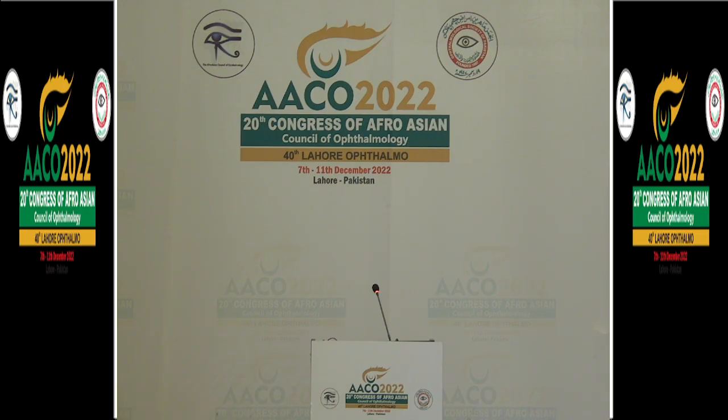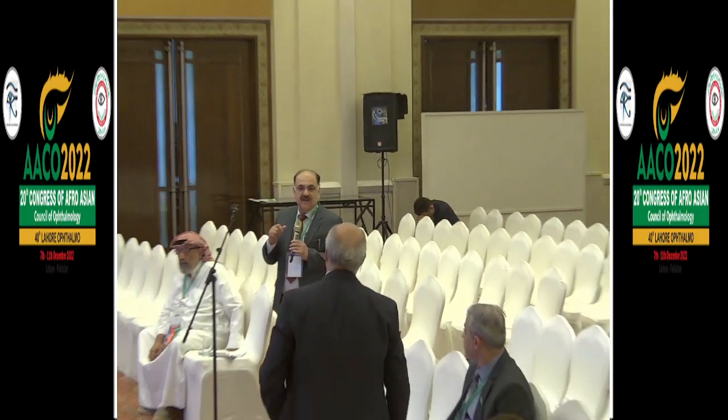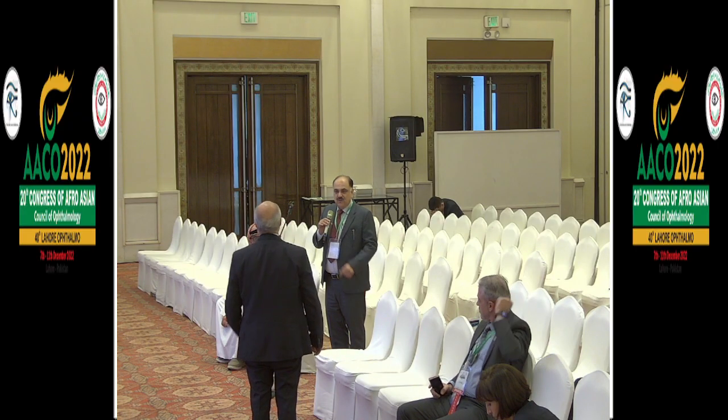Please go ahead. In the subluxated lens, could we have put the capsular ring after doing hydrodissection? You can, certainly. That's a surgeon's choice, but if you want to ask Dr. Yahya, he can answer. Dr. Yahya, can you answer the question, please? You put the iris hooks into the capsule instead of putting in the capsular ring after hydrodissection. You could have saved a step.